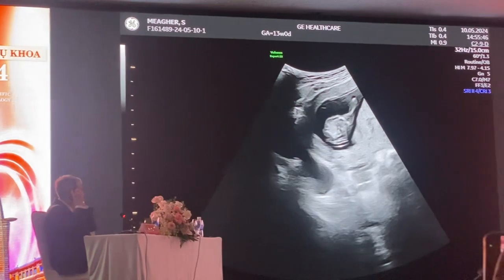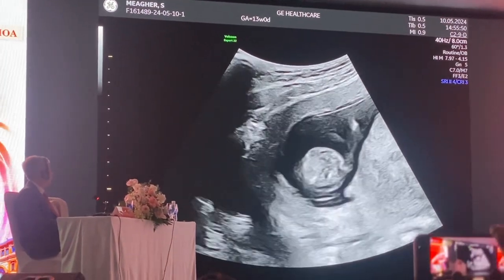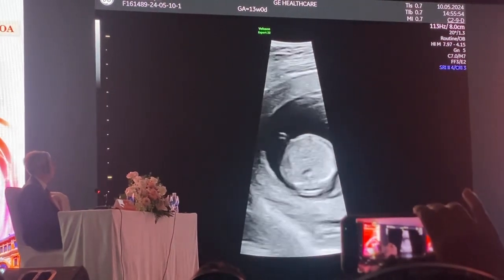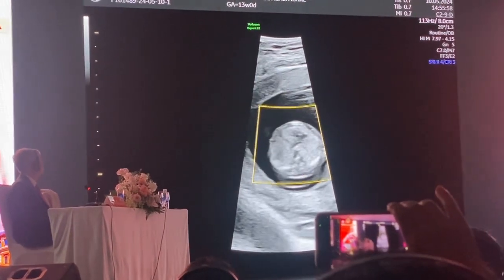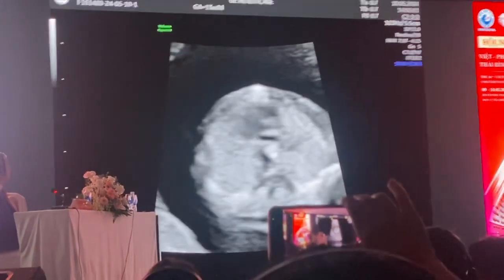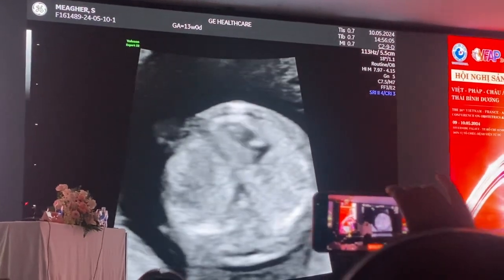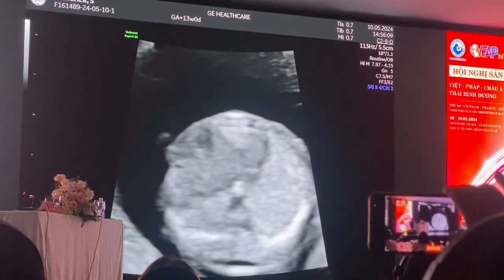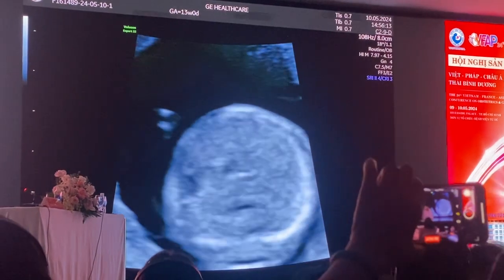The first thing that I want to do is reduce my depth, and the next thing I want to do is take down my sector width, and then go into an HD zoom. And when I'm in HD zoom, I'm then going to increase my dynamic range, and then I'm going to go into a sub-menu, and I'm going to change to a tint of ice. And then I'm going to come back to my main menu, and then I'm just going to pull back.